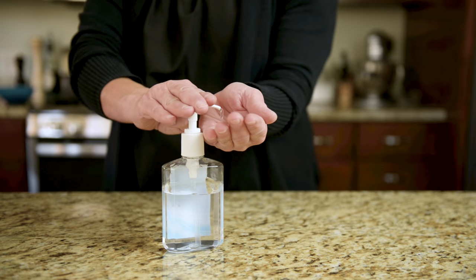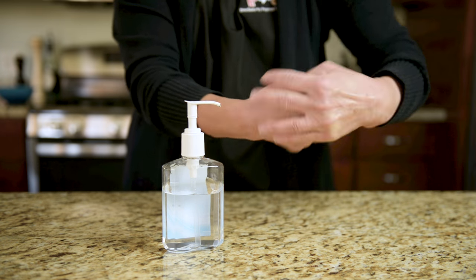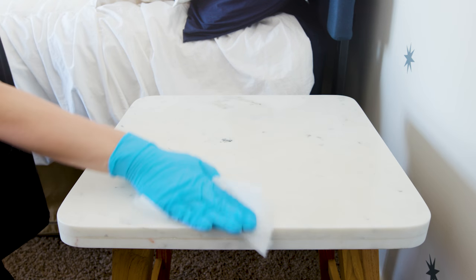Start by cleaning your hands with soap and water or alcohol-based hand gel. Put on non-sterile gloves. Clean your work surface with soap and water or a disinfecting wipe.